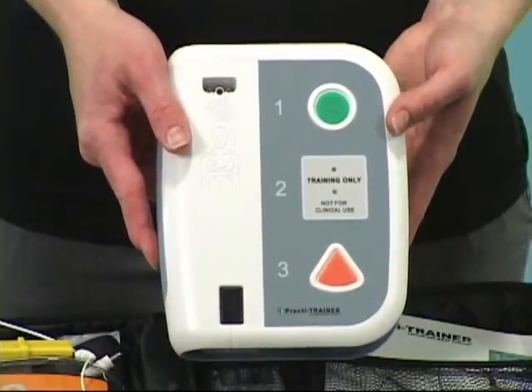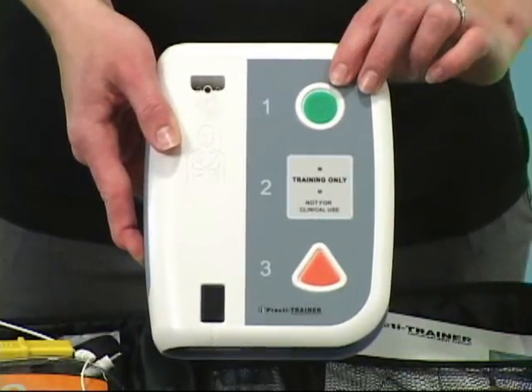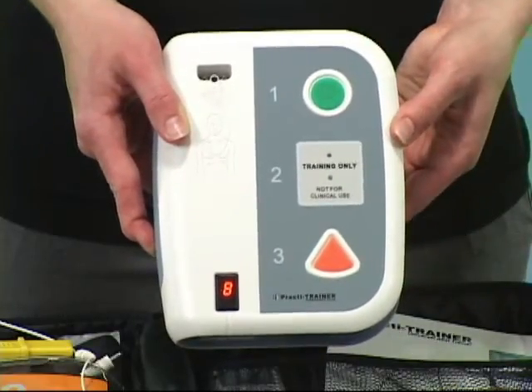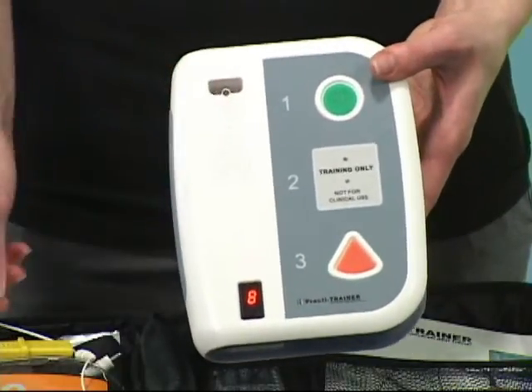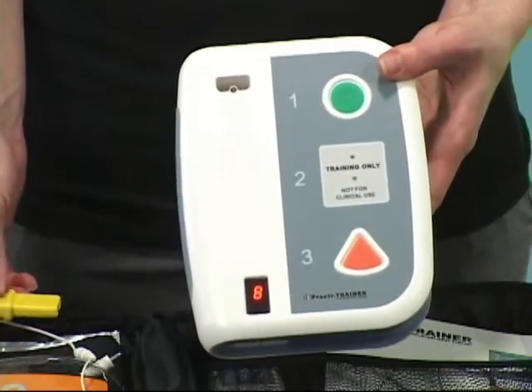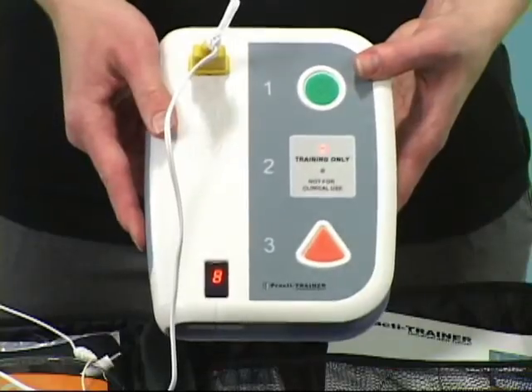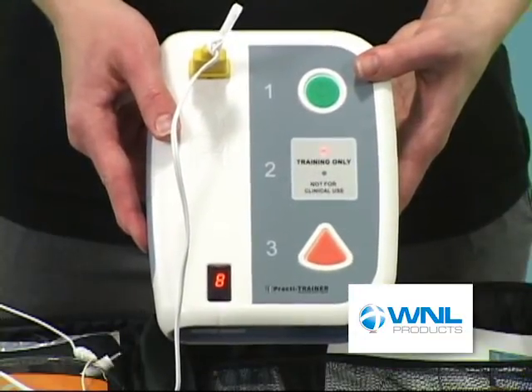Press the green button on the front and then just follow the prompts. Apply pads to patient's bare chest. Plug in pads connector. Next, analyzing heart rhythm. Do not touch the patient.